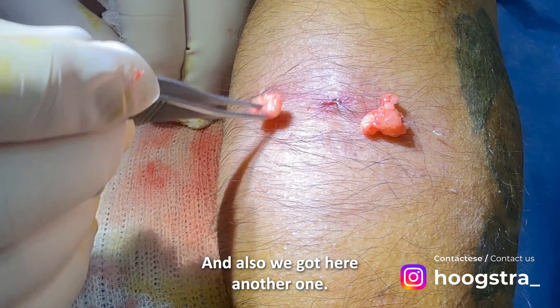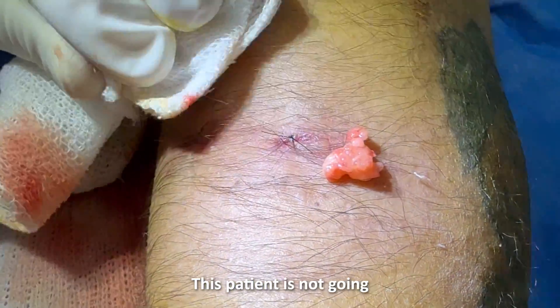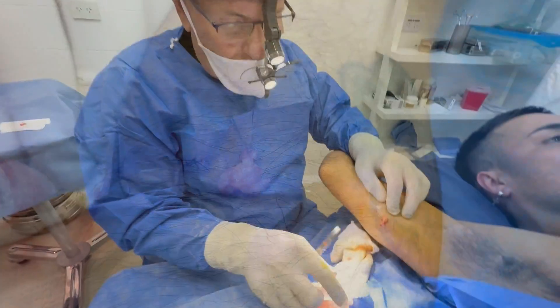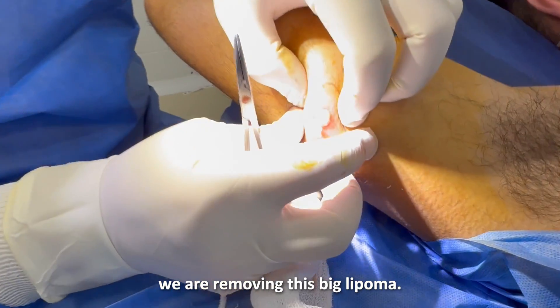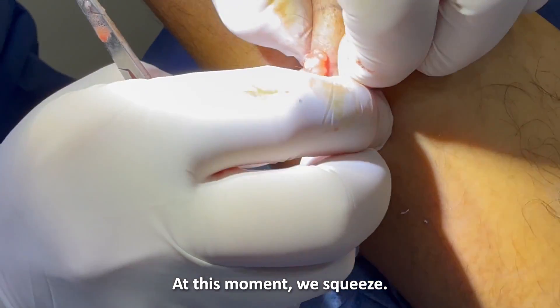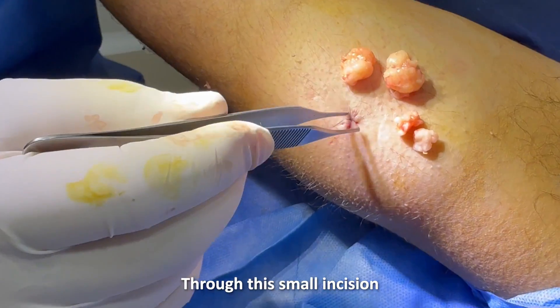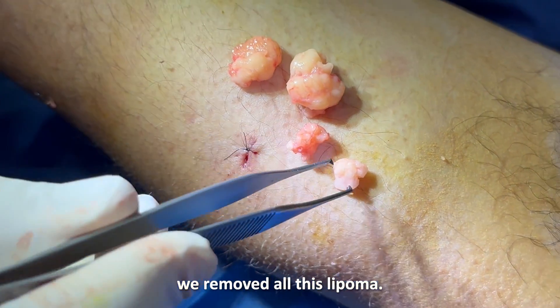And also we can see another one. This patient is not going to have a visible scar. Through this minimal incision, we are removing this big lipoma. At this moment, we squeeze. Through this small incision, we remove all this lipoma.